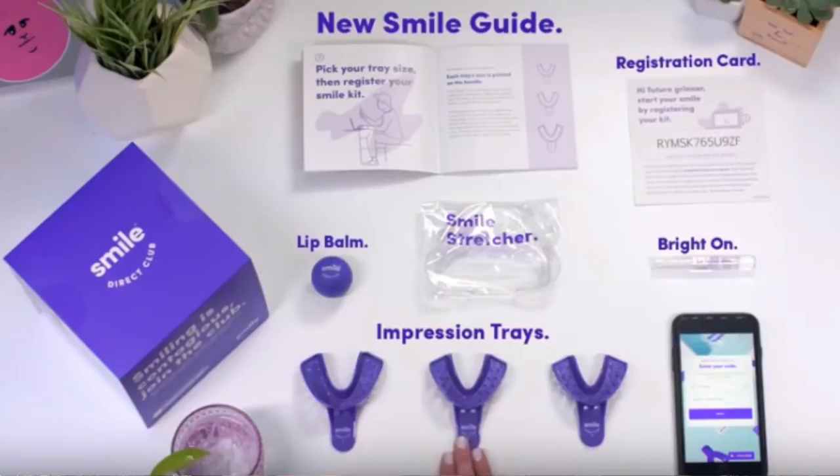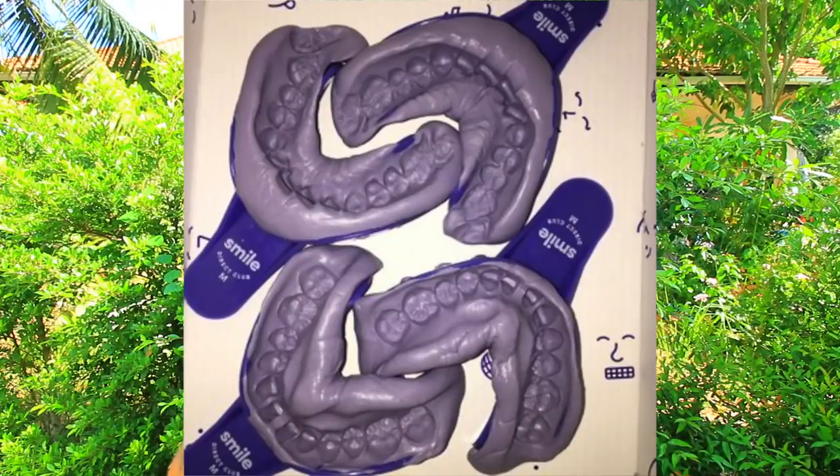The reason why Smile Direct Club appealed to me is you can live anywhere in the world and you don't need to go to a specific specialist. You can have these invisible braces — if you pay for the kit where they do the impressions for your teeth, you can find a dentist specialist who can do the impressions for you. But you can also do the impressions at home very easily with the impression kit that they send to you, which is what I personally did, and it worked very well.